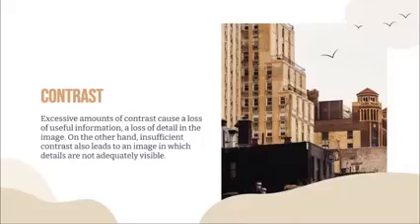So same lang, pag excessive ang contrast, saturated ang image, dili klaro ang detalye. Pag low contrast, daghan ra kaayog shades of gray, wala nakakabalo kung asa ang asa. So detail is also destroyed. The ideal amount of contrast in any image lies in an intermediate range. Okay? Again, in the middle of high and low contrast. The word optimum is used to describe such an intermediate level which is neither too much nor too little. Na lang siya sa tunga, intermediate range. Okay?